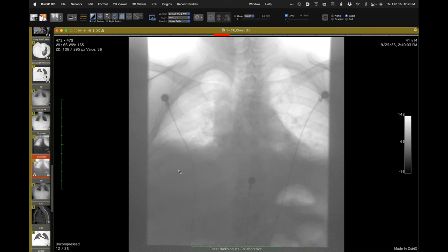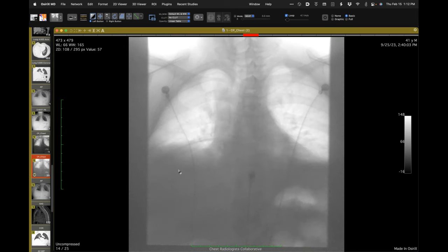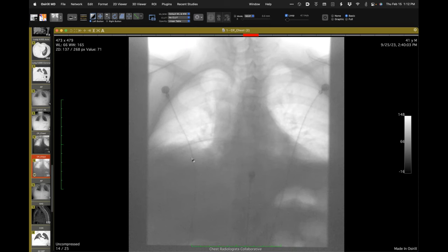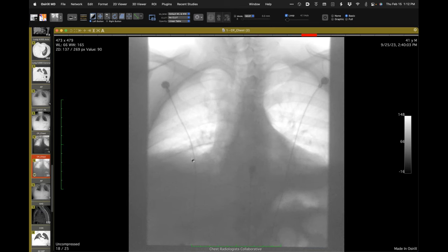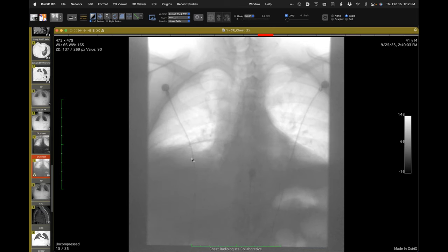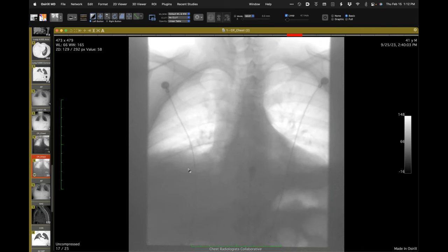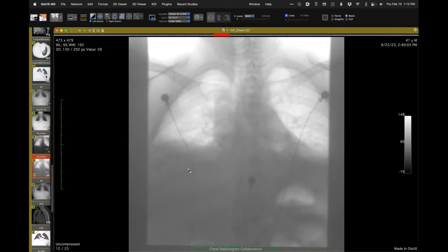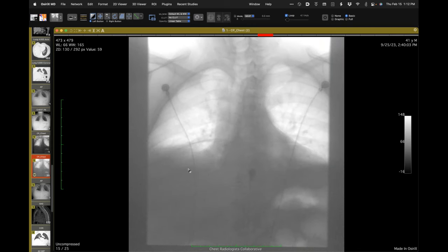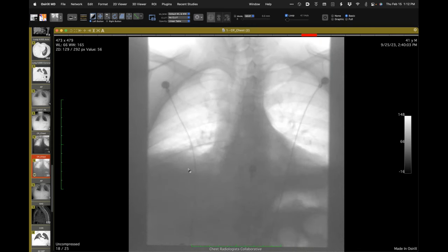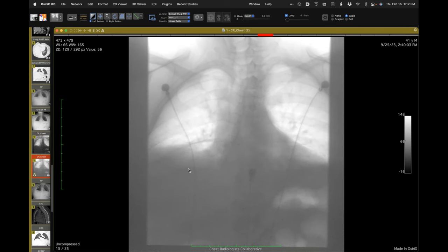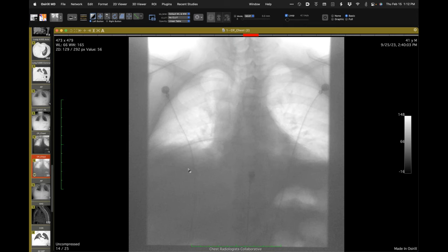Here is the problem of relative motion. You can see the ribcage moving, and the lungs can be inflated a bit from that. But are the diaphragms actually contracting nicely? If that's the total excursion of the diaphragms I'm flicking through here, that's not normal. Even though they thought the hemi-diaphragms were moving, I'm skeptical for the reasons I mentioned.